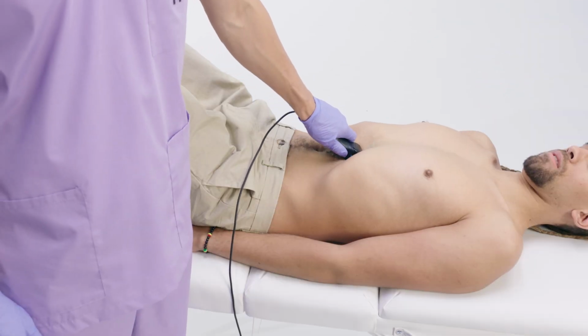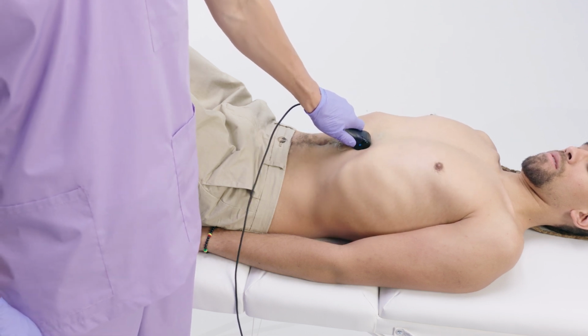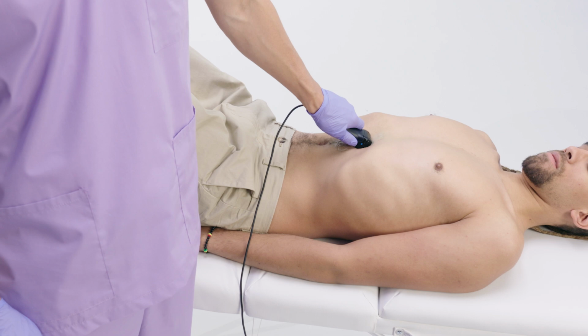Ask the patient to take a deep breath and hold it. This lowers the diaphragm and brings the heart closer to your probe, improving image quality. Mastering these small details will help you obtain consistent, high-quality subcostal images.